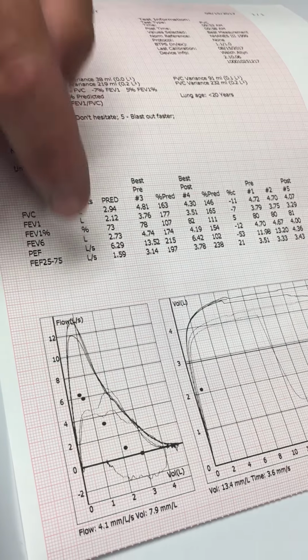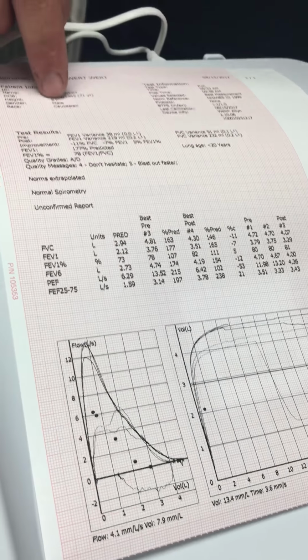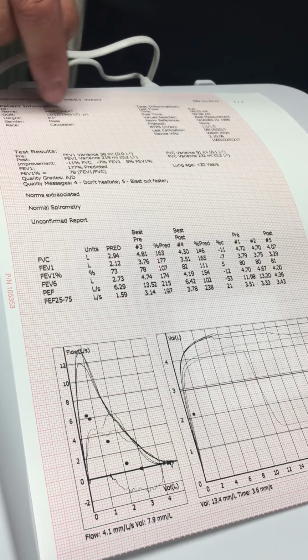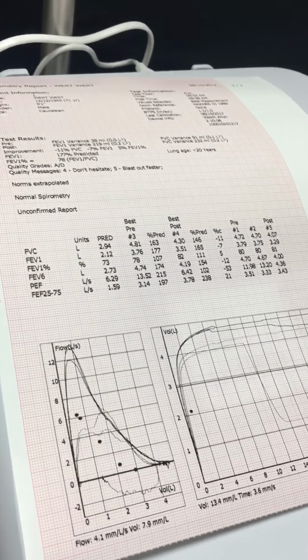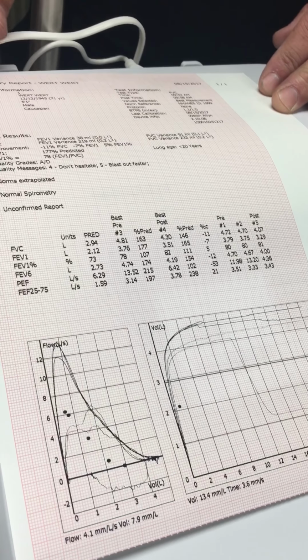This all changes, all these goals change depending on what I plug in here. If I were to change this to female or African American or Asian or whatever, all of these numbers change. That's why it's so important to have the correct patient demographics when you're doing this test.